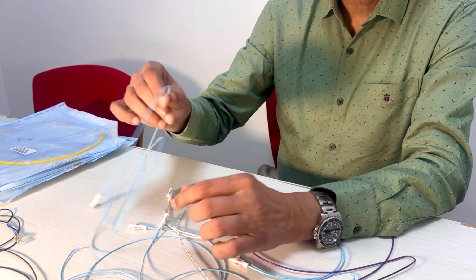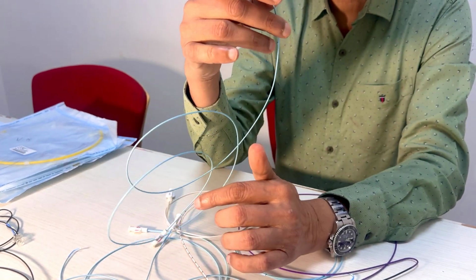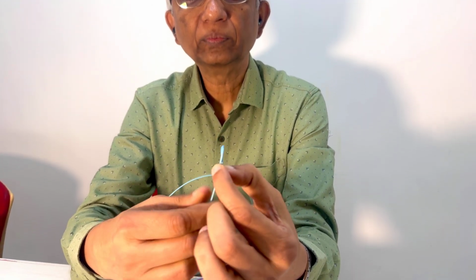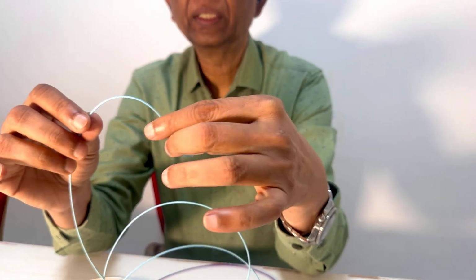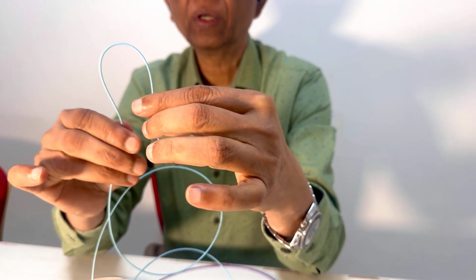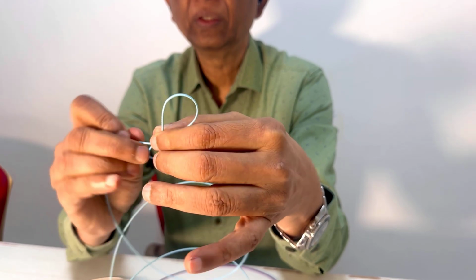I was just telling you that if you get into trouble, how do you come out? For example, this is a multi-purpose catheter. Unknowingly or knowingly, you enter into a vessel, and without any knowledge, you're torquing this vessel. Now, what happens? This catheter gets knotted, right? It becomes knotted like this, and now you are in a very, very awkward position. Imagine you're across the aortic bifurcation. Your catheter is down here. You have not realized you are torquing it for some reason, and this whole thing will finally get knotted.